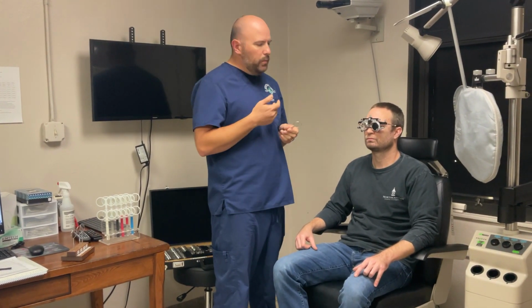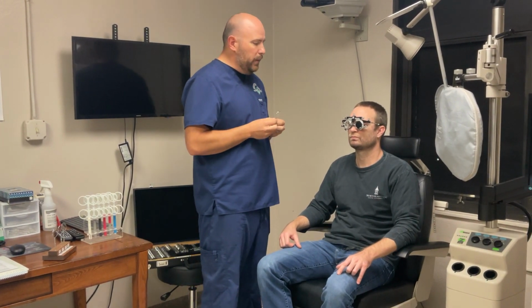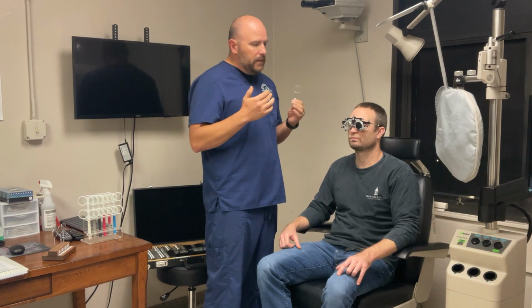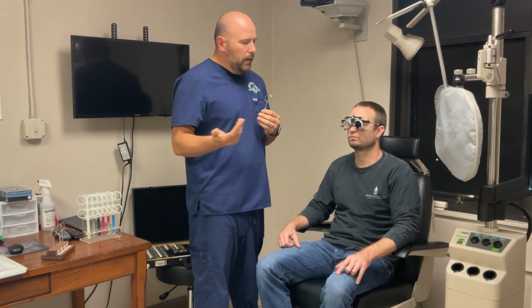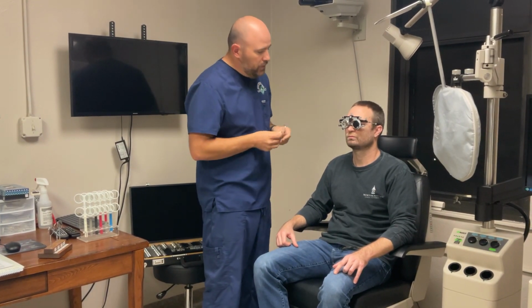And so since we still have some cylindrical power in here, what I'm going to do is just quickly check the axis and make sure that we don't need to make some change that will ultimately increase his cylindrical power. So this may be a little bit different from the way the trial frame proficiency may go, but it is a realistic thing that occurs all the time with our low vision patients.